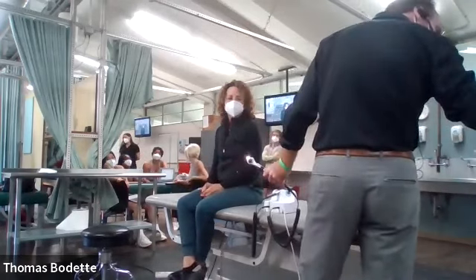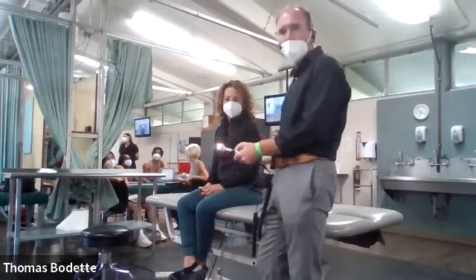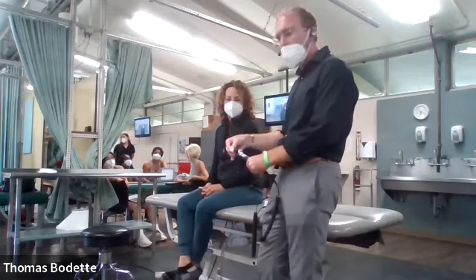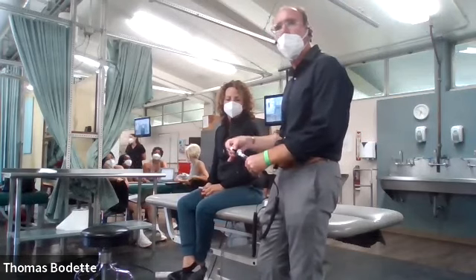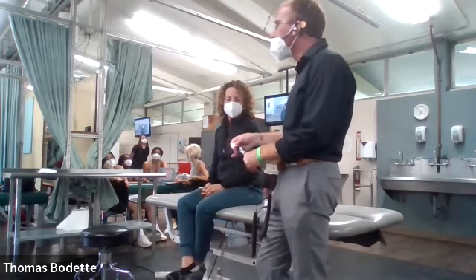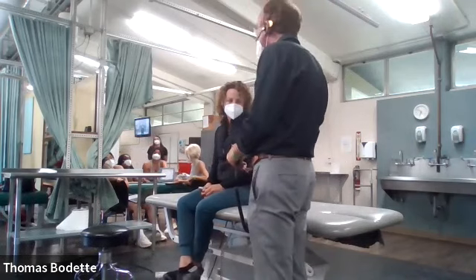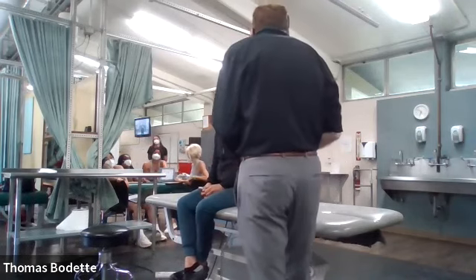Just give me a second here. Everybody see what I'm doing? I'm cleaning my equipment in front of the patient. If you're using permanent specula, then you want to make sure and clean using alcohol. If you're using disposable ones, obviously just pop that in the garbage.